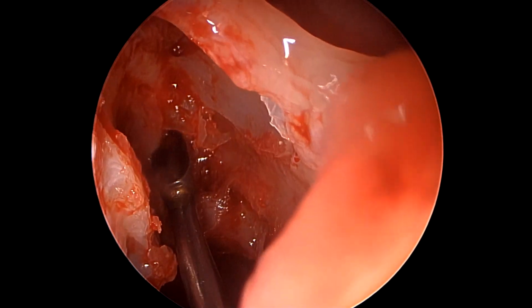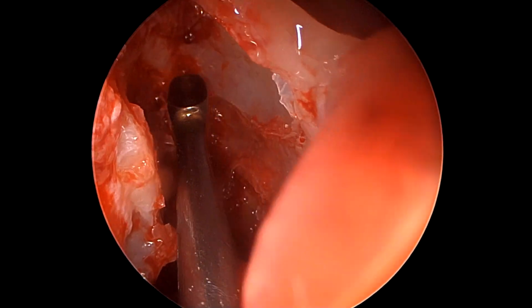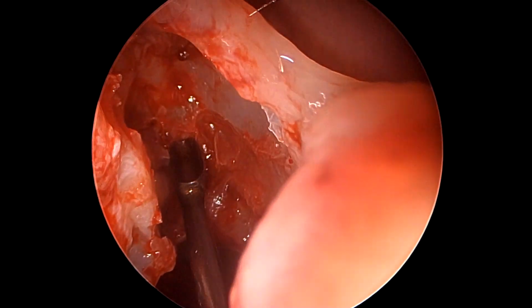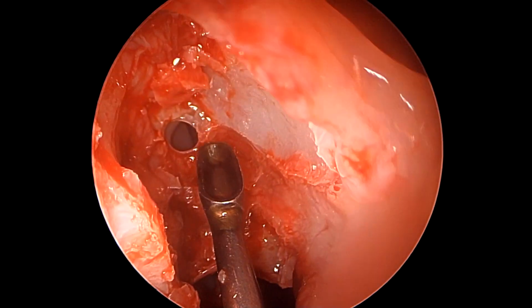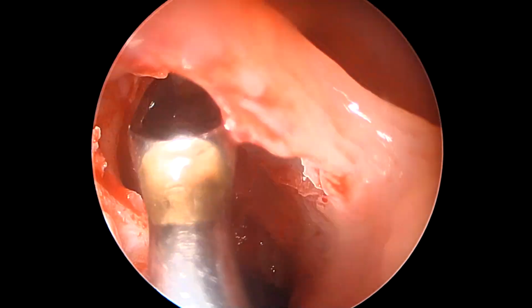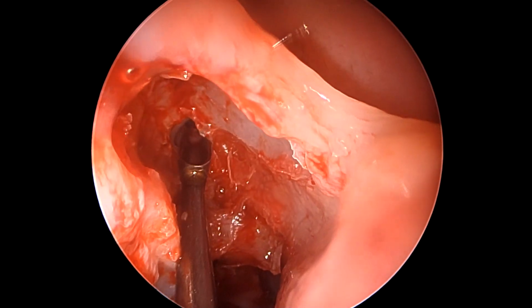As we have seen here now, the agger nasi and the first cell have been removed, and now we are left with another frontal recess cell. Now, contrary to belief, this is not the frontal sinus that we are in. This is merely a cell, and we need to again find out the frontal sinus. Now, we are again fracturing the posterior wall of this type 2 or type 3 cell, which sits above the agger nasi.